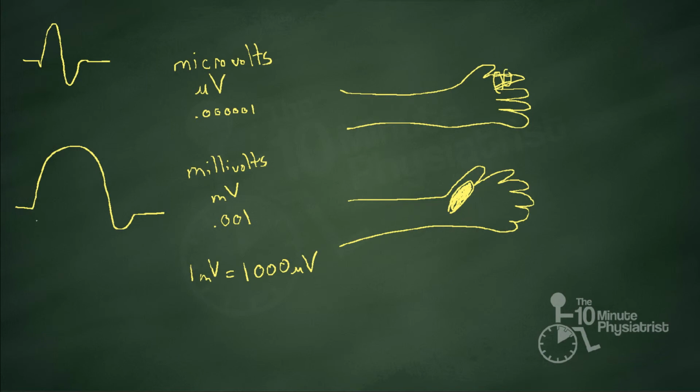The other major difference, and we'll end with this point, is the onset latency. For motor nerve action potentials, we measure that onset latency at the initial negative deflection from the baseline. For sensory nerve action potentials, we measure that initial deflection from peak. Now, why would anybody devise two different methods of onset latency? It makes a difference in what you're seeing in this potential, or what you're actually measuring. And we'll talk some about this in more detail in subsequent videos.